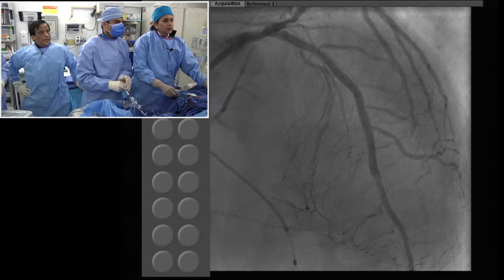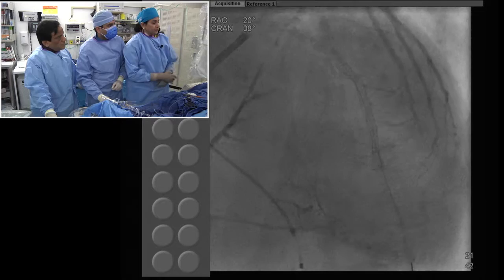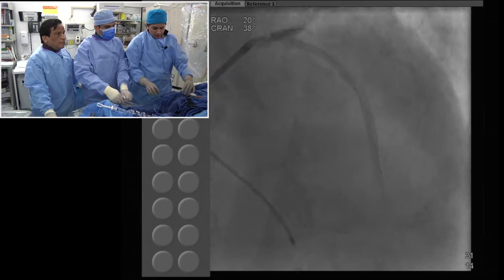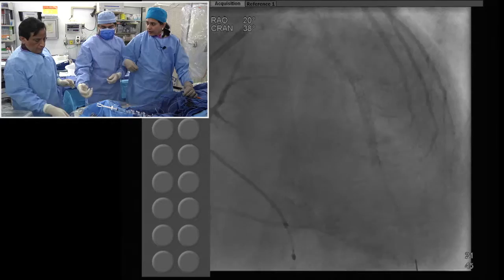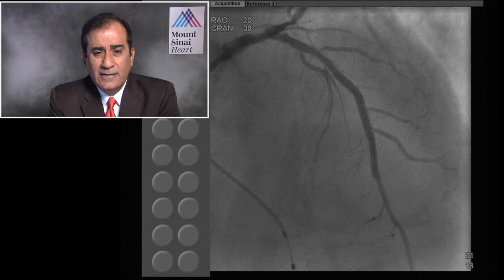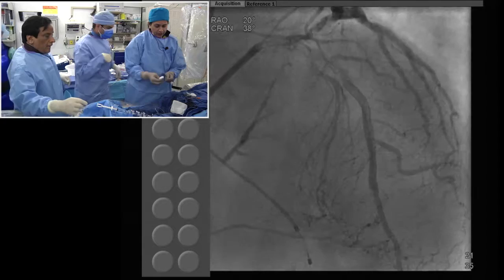The stent in the mid already looks very good. A 38mm or 35mm stent will cover the whole thing. We are going with 38 for full coverage. Approximately for the left main we can dilate to 4.0. This patient did have CT as part of the workup. We know both sides were bad, but CT is a must. For another patient done yesterday with severe AS and a gradient of 60 — who had a graft problem — we did orbital atherectomy, put two stents in the circumflex, then did a balloon valvuloplasty. In that case, we would let the patient go and come back in 4-6 weeks for surgical consultation and whatever is needed in one shot.